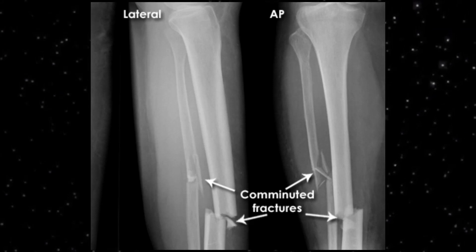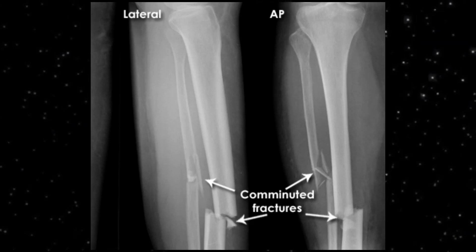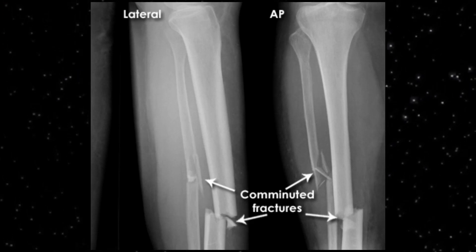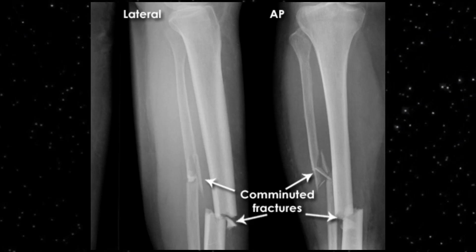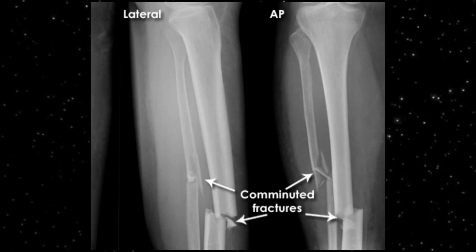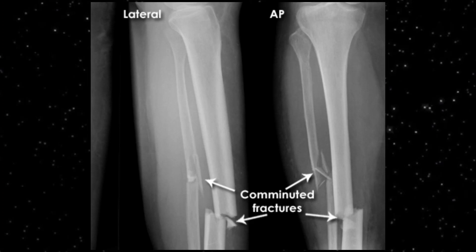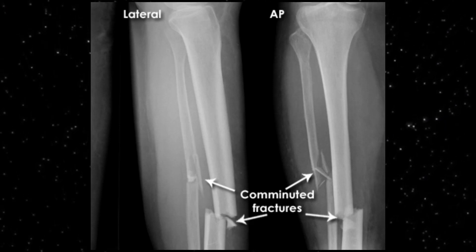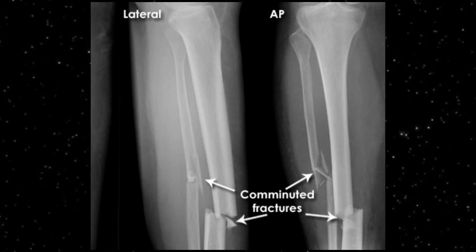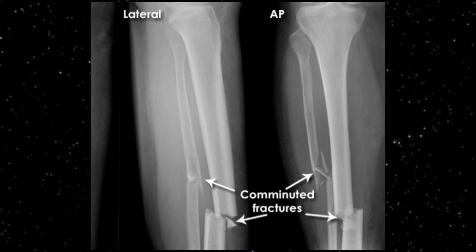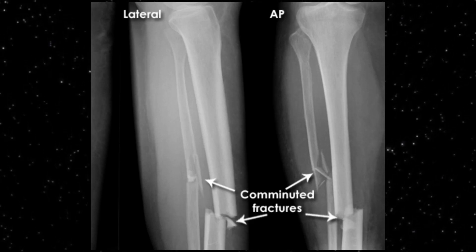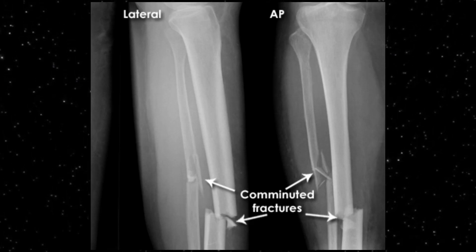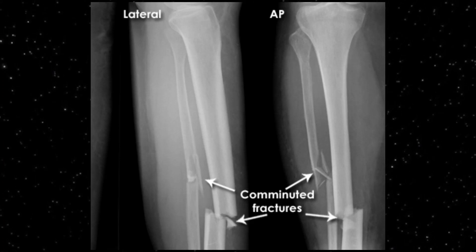Comminuted fracture is a type of fracture where there are more than two separate bone fragments. This radiograph of a mature skeleton of the lower leg shows AP and lateral views with fractures of both tibia and fibula — both are spiral fractures, both are distal fractures, and both are comminuted fractures. When multiple fragments are present, or more than two bone fragments are involved, that is called a comminuted fracture.